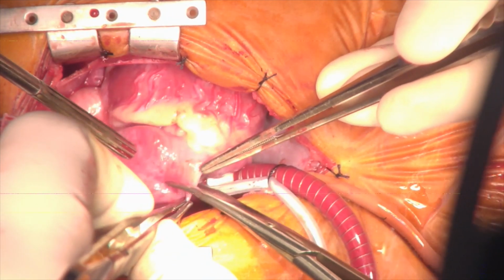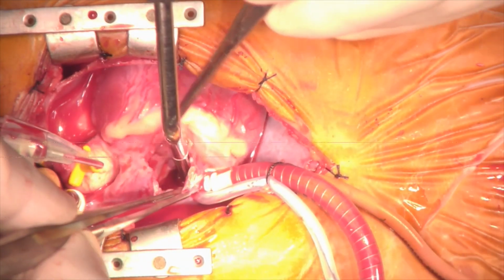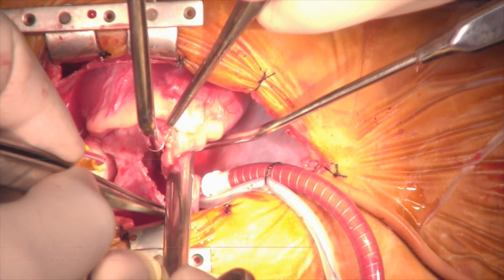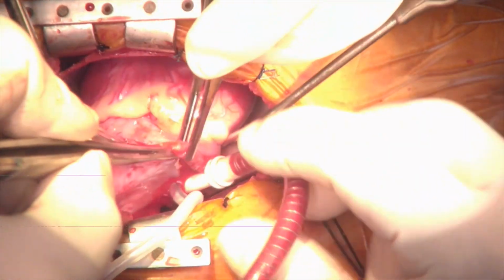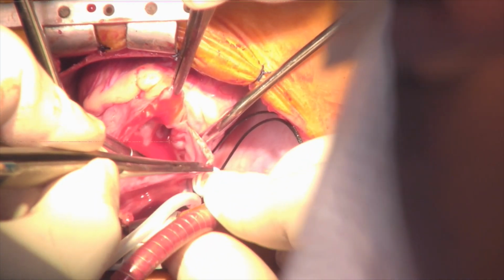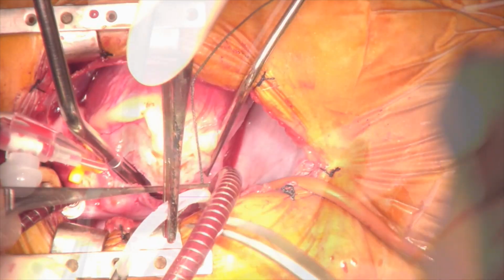The right atrium is opened. The tip of the inferior caval cannula can be seen within the right atrial lumen. The inferior caval snare is loosened and the spout of the inferior caval cannula is turned around and inserted into the inferior vena cava. The inferior caval snare is then reapplied, and the cannula is secured to the snugger.